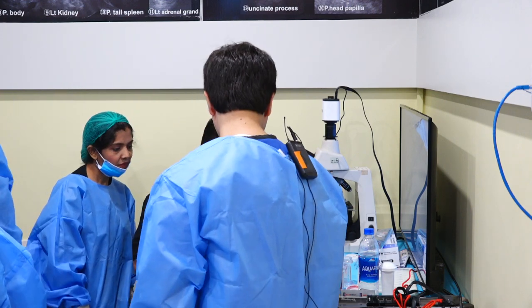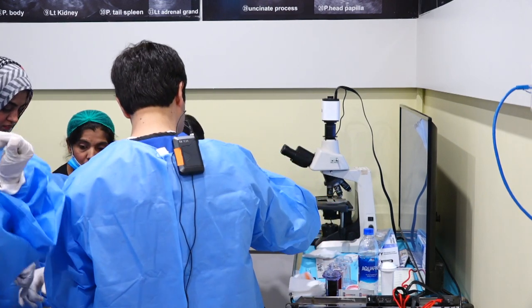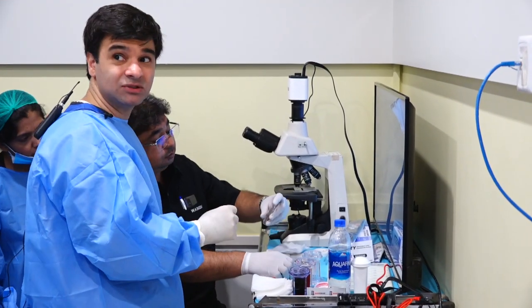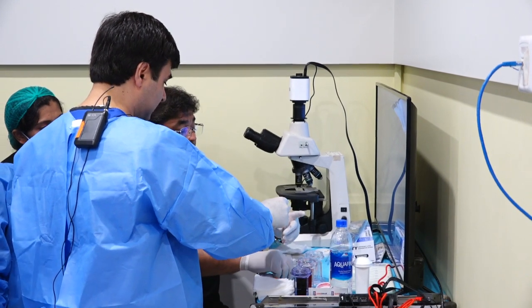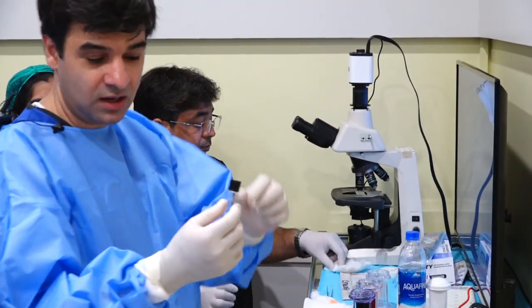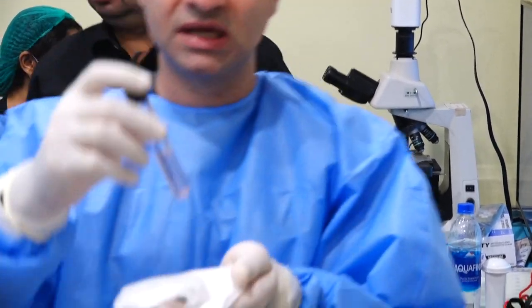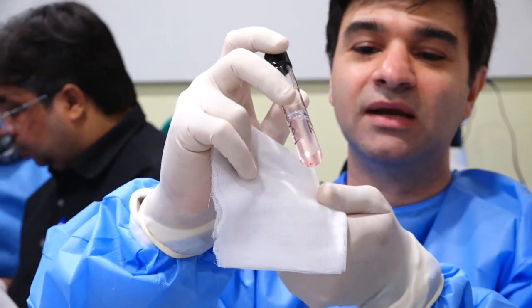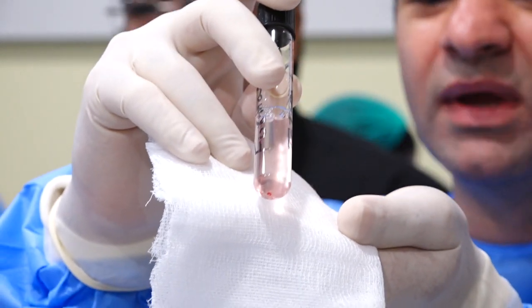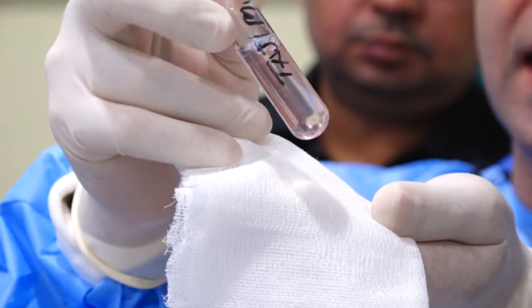Okay. Dr. Hassan, we're going to just quickly show you what our sample looks like, and what would you consider an adequate specimen? So how do you determine, can I have a white background? So Dr. Hassan, here we're seeing the specimen and I noticed some cores at the bottom. How would you recommend we assess for adequacy of the specimen when you're evaluating something like this?